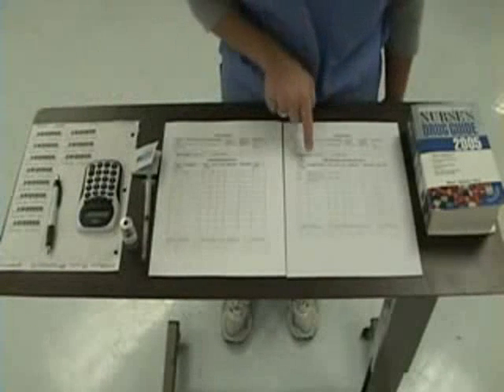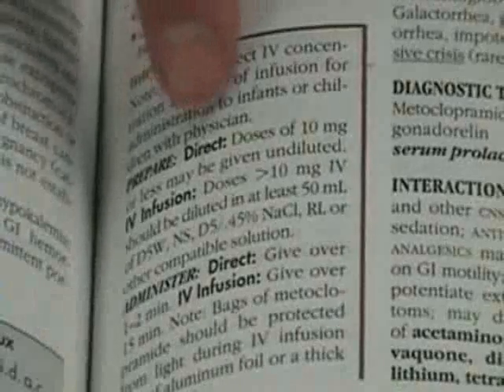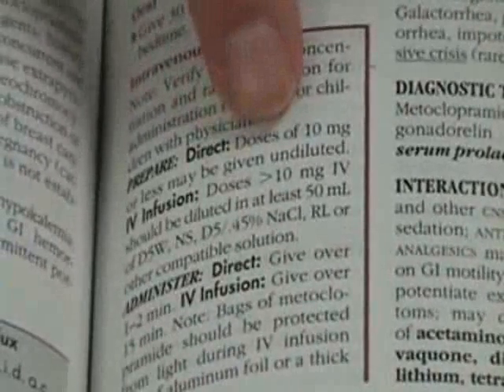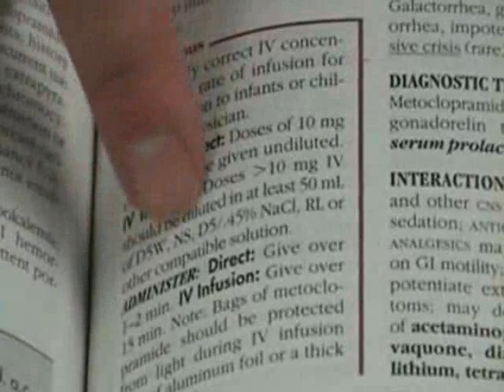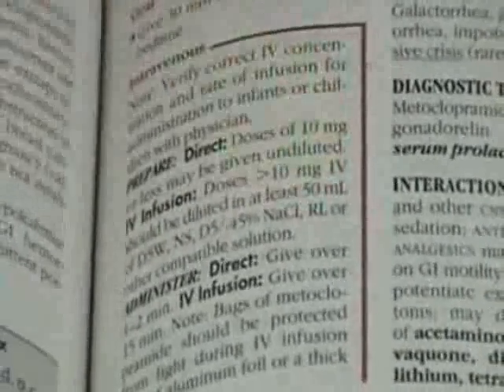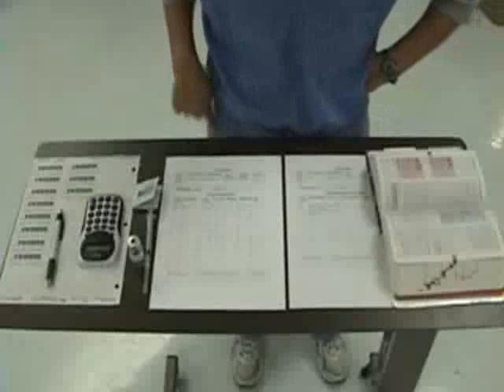The first thing that I need to do is check to see if the Reglan IV push is compatible with the normal saline IV fluids. I've checked the drug book and it states that Reglan can be given by direct IV push and does not need to be diluted. I have also checked to see what fluids are compatible with Reglan, and those fluids include D5 water, normal saline, D5 half normal saline, and Ringer's lactate. My patient today has normal saline running through their IV, so the Reglan will be compatible with my running IV fluids. I will now draw up my dose of Reglan.